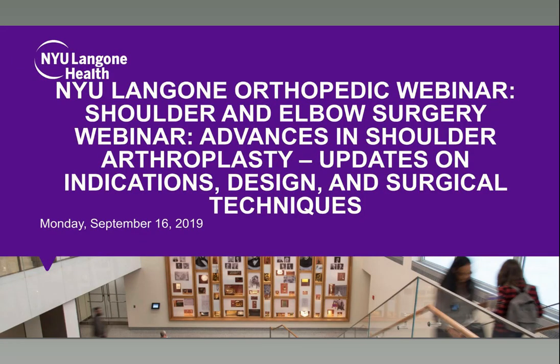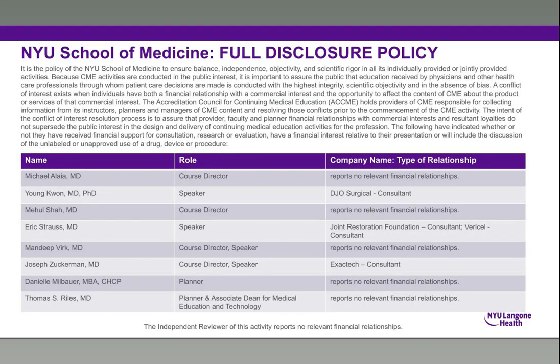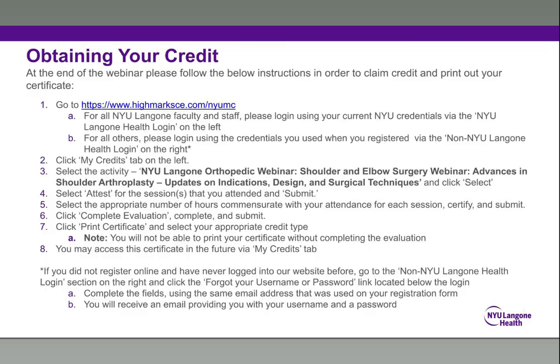So just because of that reason, I think the number of patients that are going to require reverses is going to go up. We've been putting in anatomic replacements for a while now. Obviously, some of them are failing, and then certainly for revision cases, almost all of those are being treated with reverse replacement. So the indications are increasing for use of reverse, but the patients that need a reverse is also going up as well.